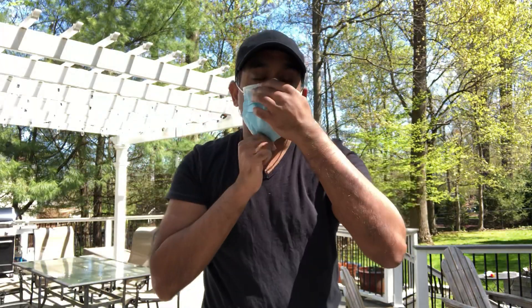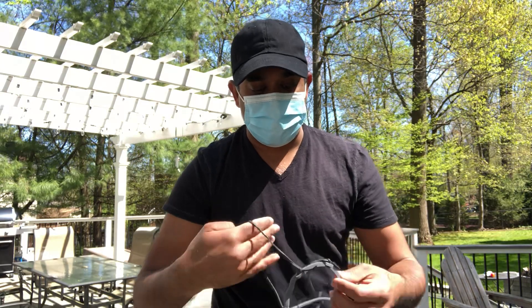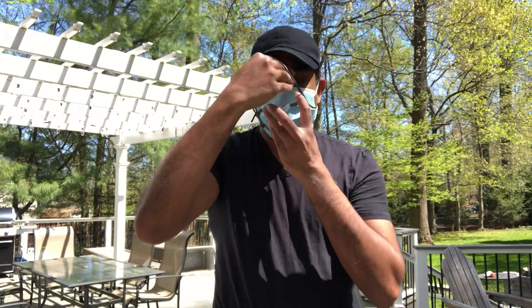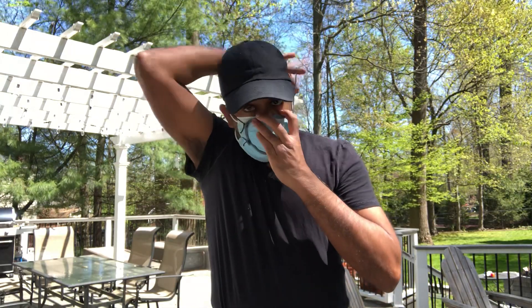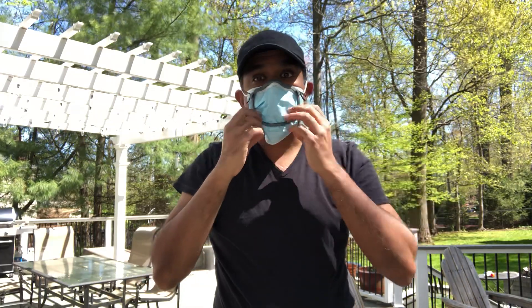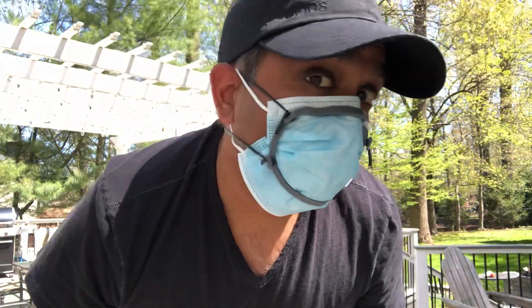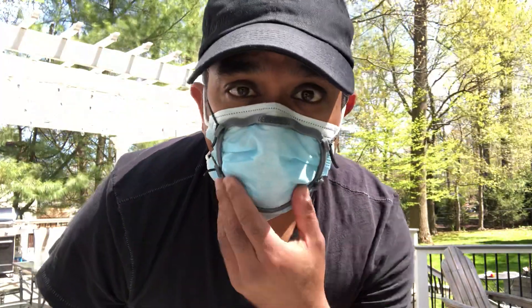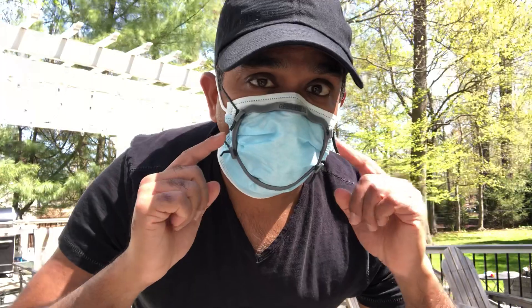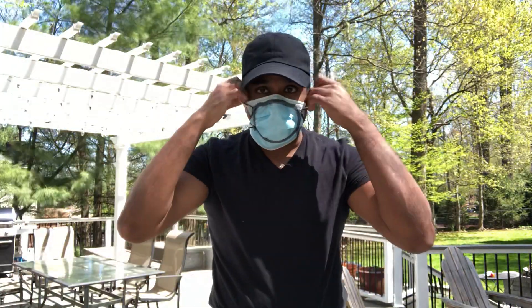It's fit to your face. The way you actually use this is you put this mask on — you can work with any mask, Level 1, Level 2, or Level 3. Then basically I put this on. And there we go. Now I have a really good fit around my face, and there's going to be very little debris or aerosols going in the sides. That's kind of how this works.